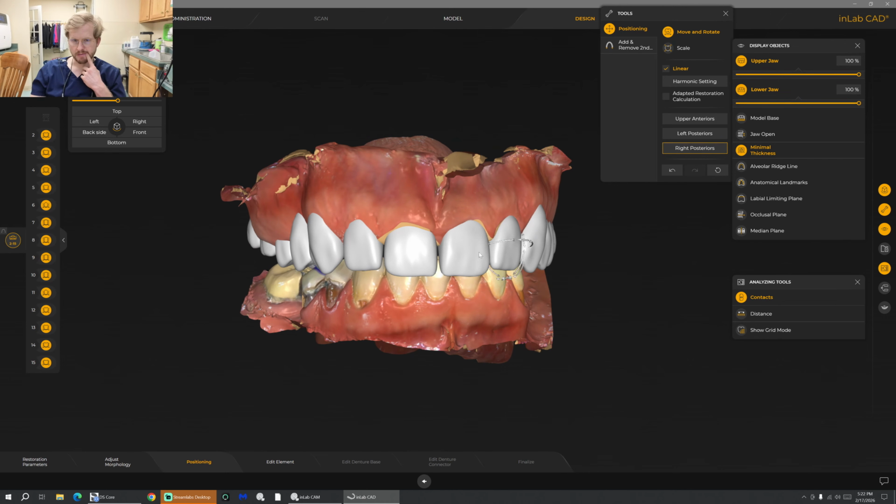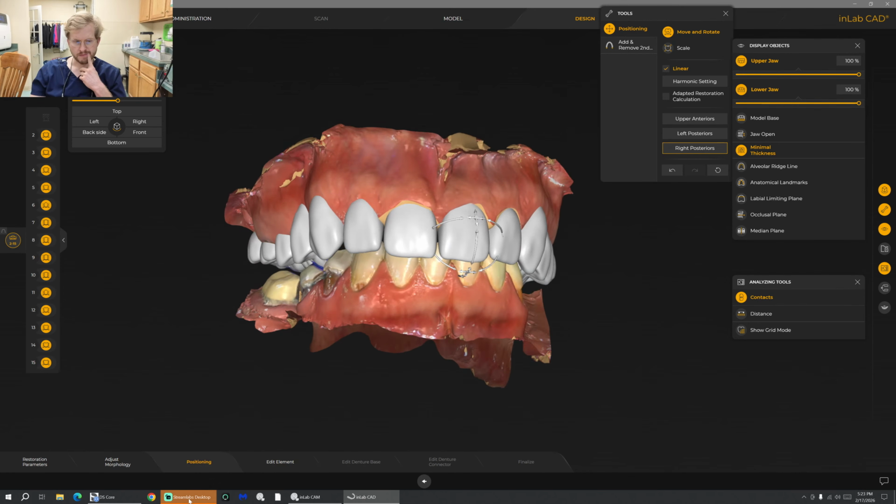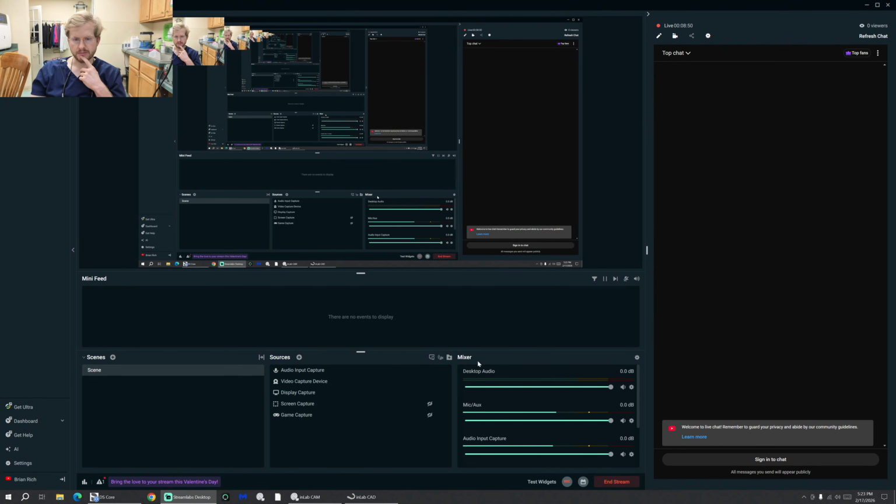Now, like I said, we're probably going to have to open his vertical some. I'm going to turn off the screen here for a moment and check something. I don't want to give away any PHI, so I'll turn it back on in a moment.